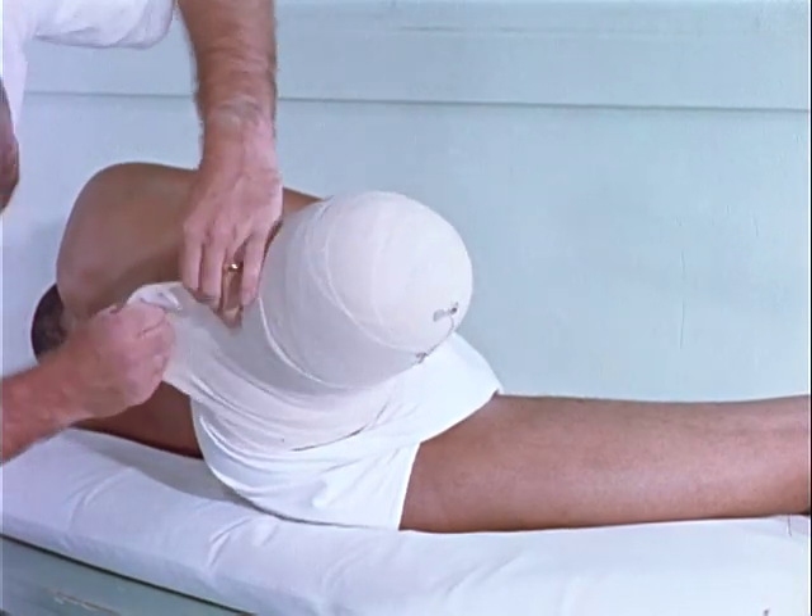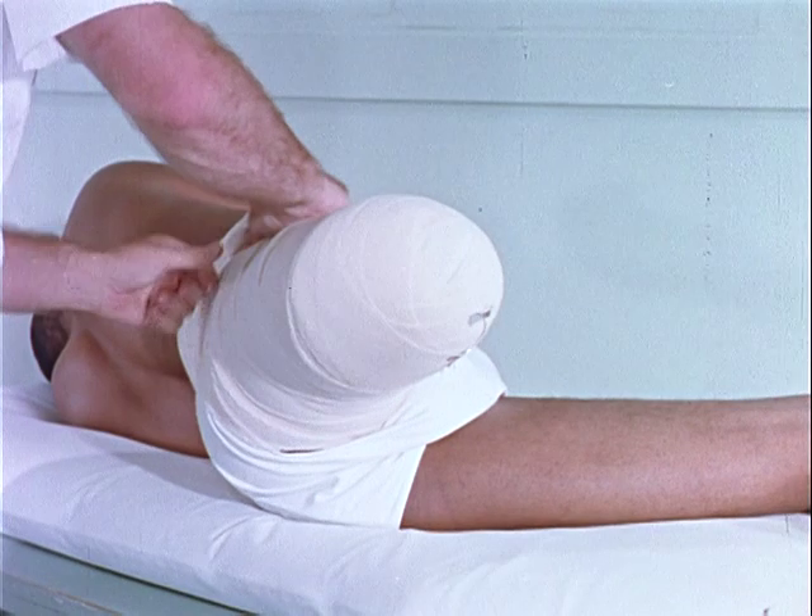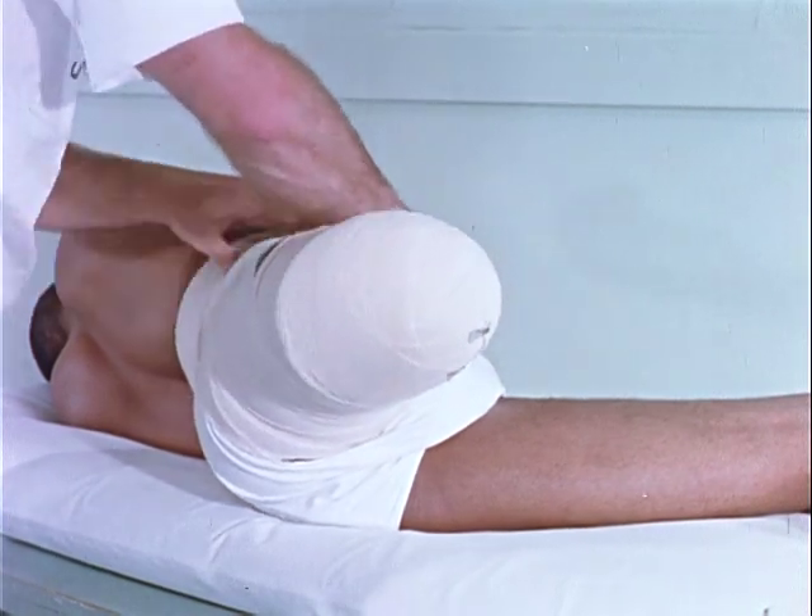The final bandage is crossed posteriorly to maintain hip extension and pinned to prevent slipping.